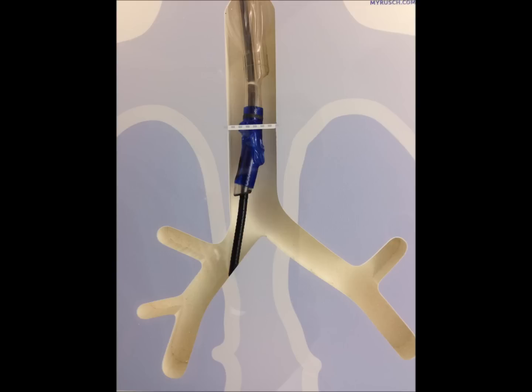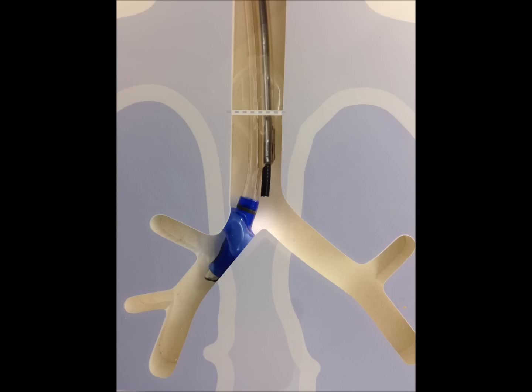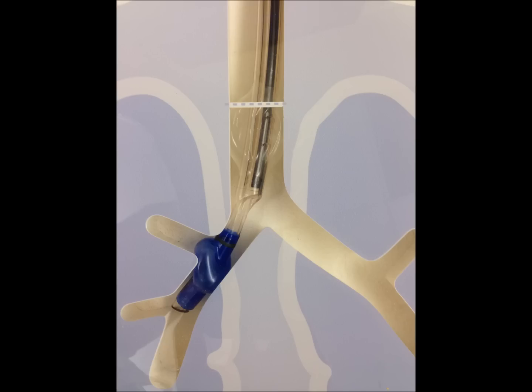Here, we're actually in good shape — this is a properly placed right endobronchial tube. There's a Murphy's eye here, so you're ventilating the right upper lobe. If you want to ventilate just the right side, ventilate through the endobronchial port, ventilating all three lobes. You can confirm its placement by going down the tracheal port, seeing the carina, and seeing that balloon just distal to the carina. If you are doing a left-sided case, you can ventilate through this port, but it's just much more difficult to get this side correct. Most residents who have come out of their residency state they've never inserted a right-sided endobronchial tube. A right-sided tube that has gone down too far will completely block the right upper lobe, so you're ventilating only the right middle and right lower.